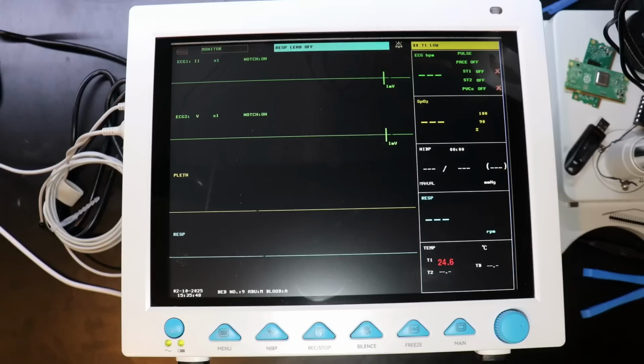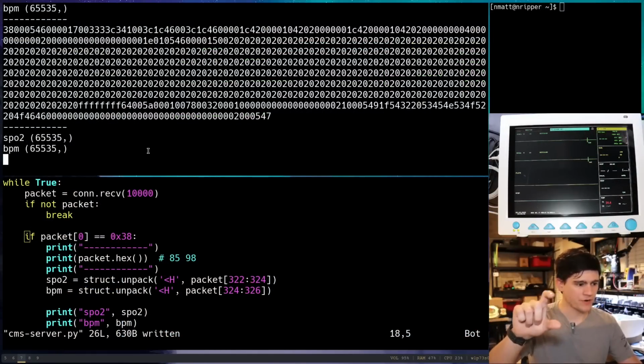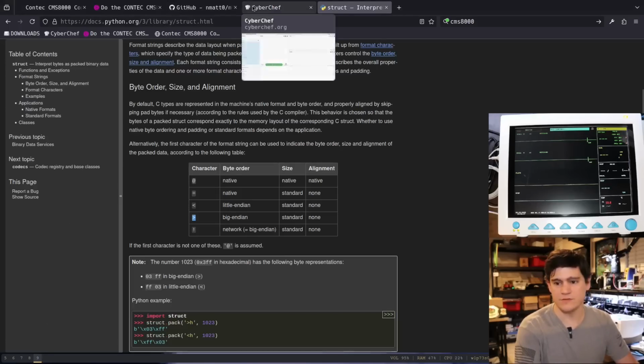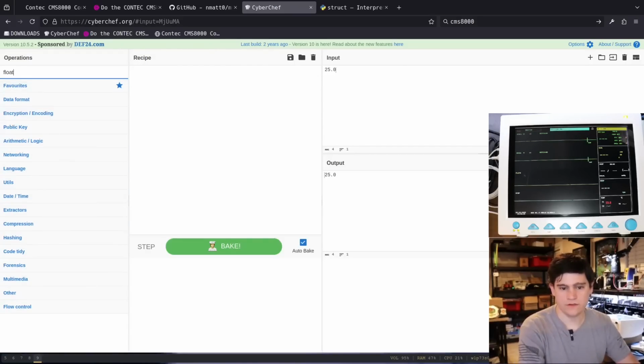Because what I want to do is I want to get that temperature to stabilize, and then over here, I'm going to hit Control C, and we're going to be able to find the float inside of this data somewhere. So, okay, I'm going to hit Control. When it goes to 24, okay, I stopped it. We're coming over here. So 24.0. We want that to be a float, and so what we're going to do to find out what that should be is we're actually going to come over here and use CyberChef. So if we want something to be 25.0, and we can say, float. Oh, really? Does it not like that one?